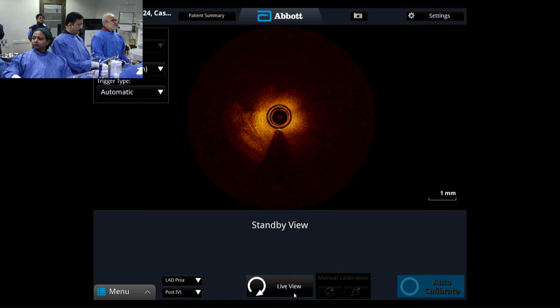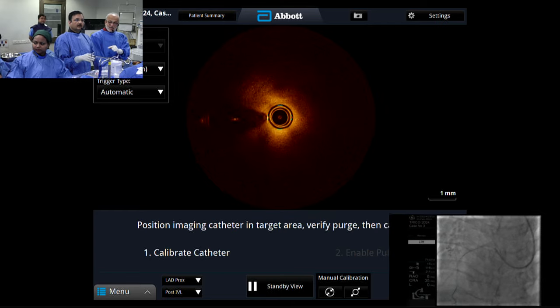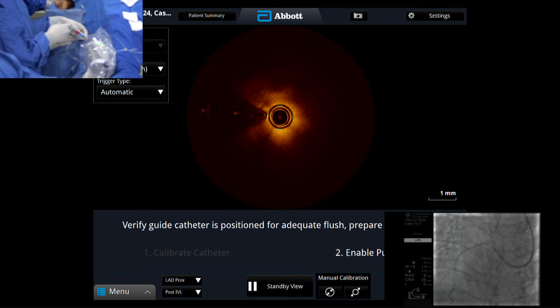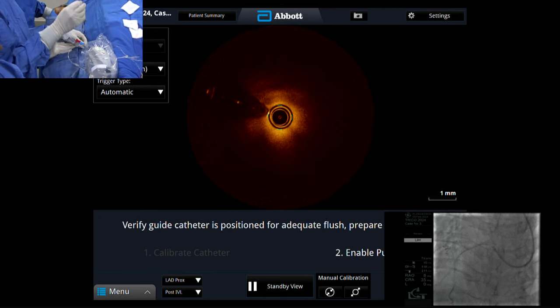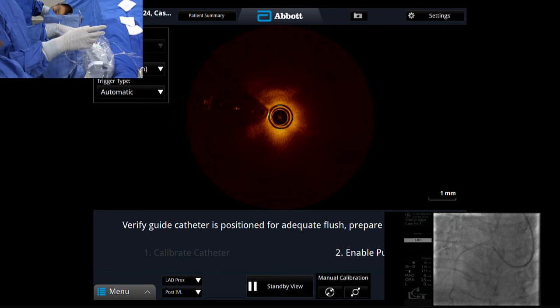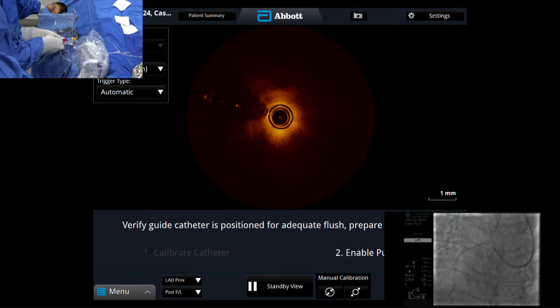Let's go in. Sanjay, now how are you going to inject? Keep the camera focus here. Whenever he gives the enable command for the OCT, I will wait for a second, then inject very slowly just to fill up to the lesion very faintly, and when the middle mark starts moving proximally, that is the lens of OCT, I will inject very fast. I am ready.